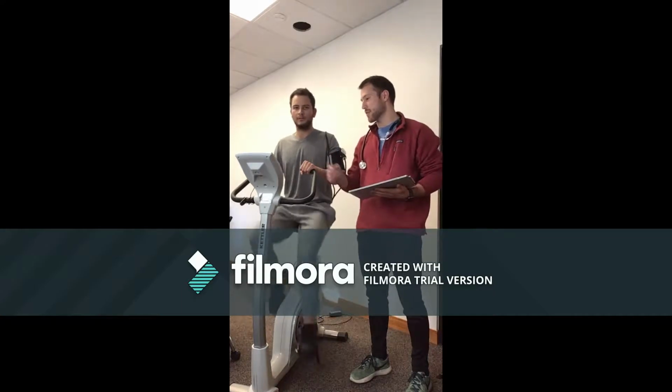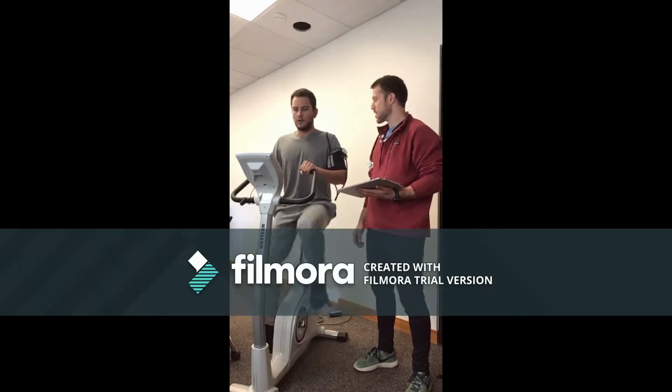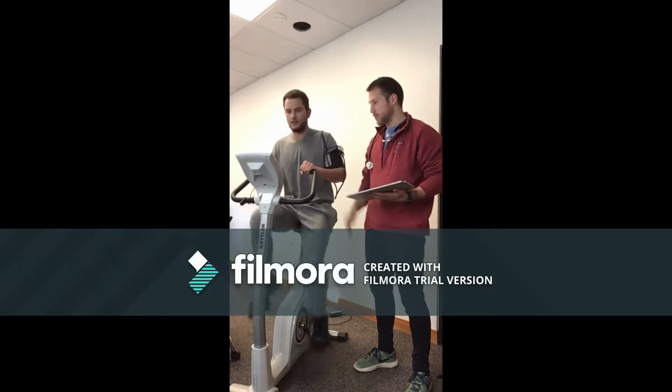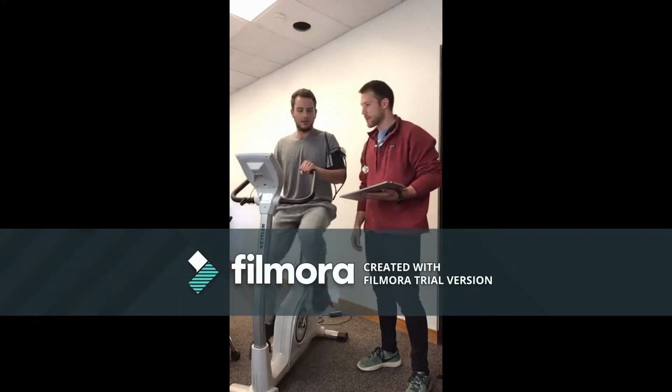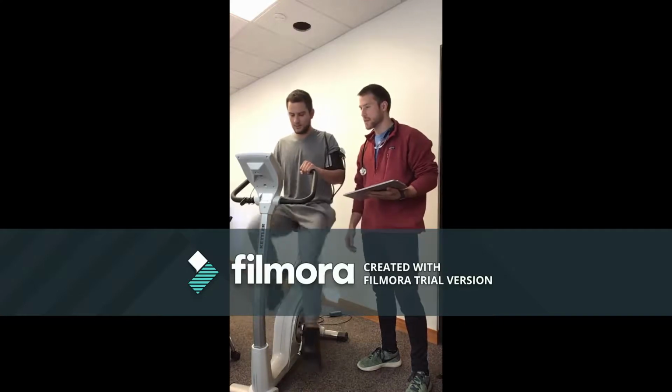Wattage is at 75. We chose that because you're in good shape. And you just reported that you had an RPE of 8, so we're in about the right range for your warm-up here. We've had you going for 3 minutes.